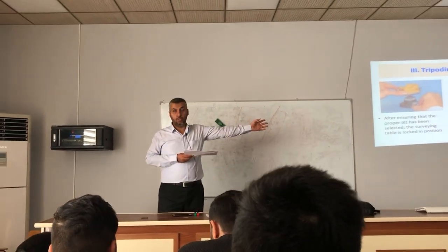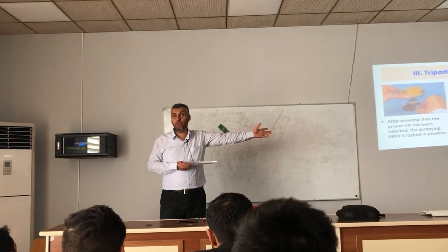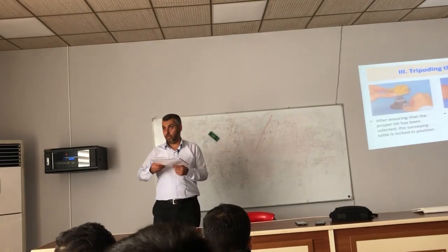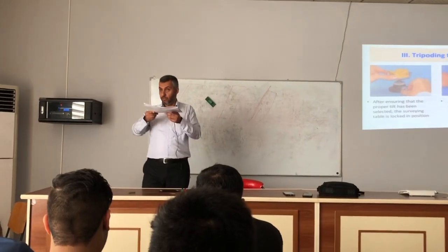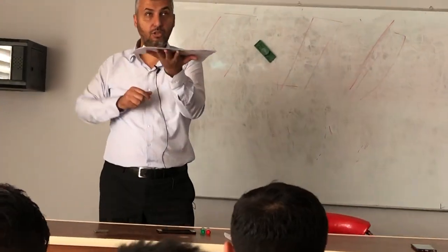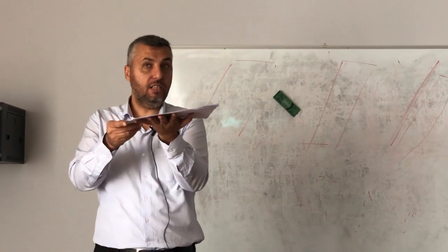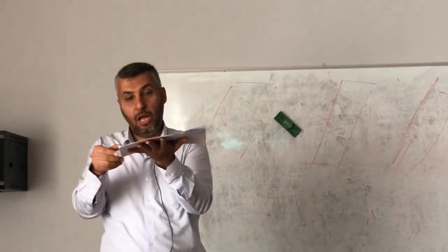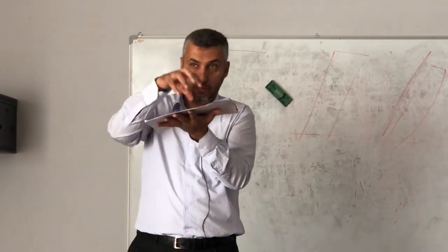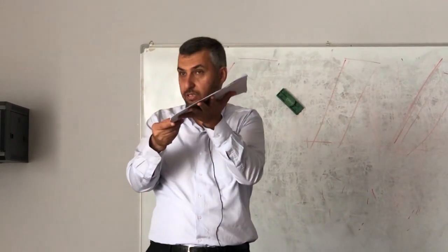We don't do this to form or to know the most desirable path of insertion or the most desirable tilt, but to preserve it. For example, this is the cast, 0 tilt. I have to change it because I have a design in my mind that cannot be made on this 0. I will tilt the cast like this. I choose the best tilt. This is the tilt.